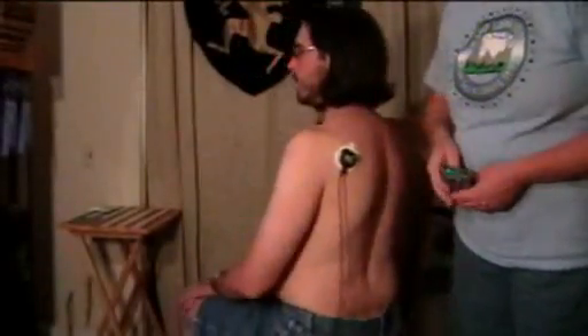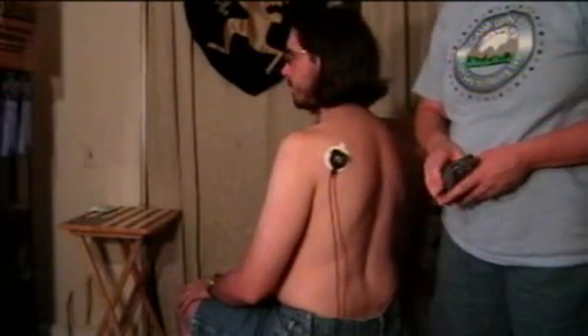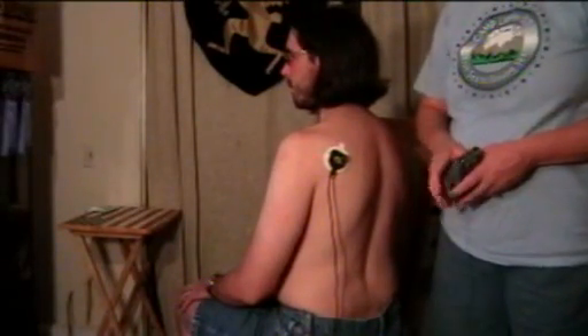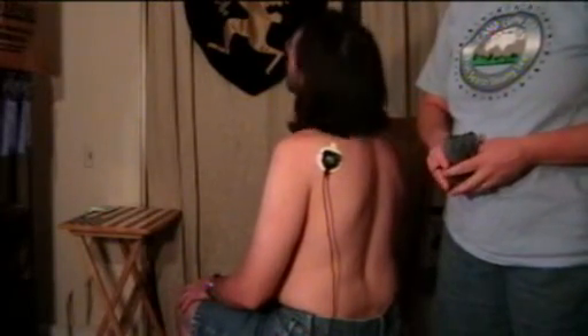Hi there, my name is Kate and this is my lovely model Tom. We are going to try and demonstrate where the electrode would go for trying to contact the infraspinatus muscle, which will perform an external rotation movement.